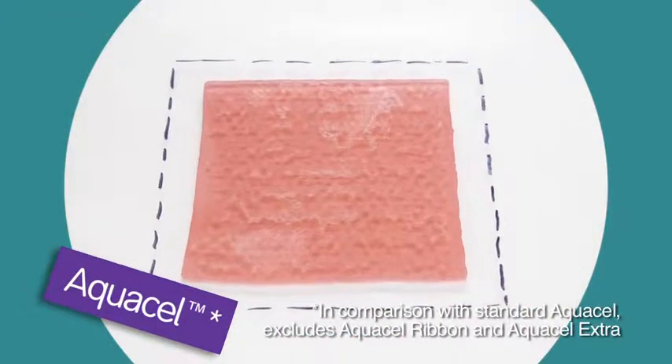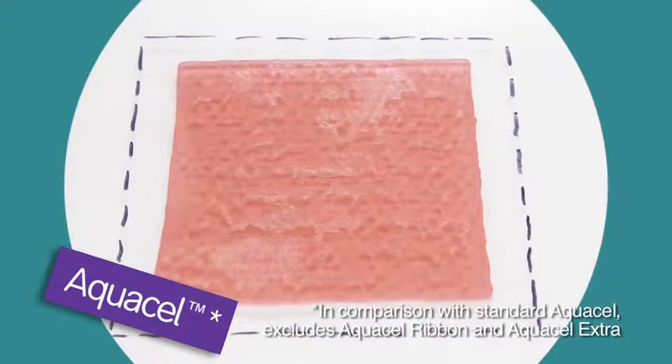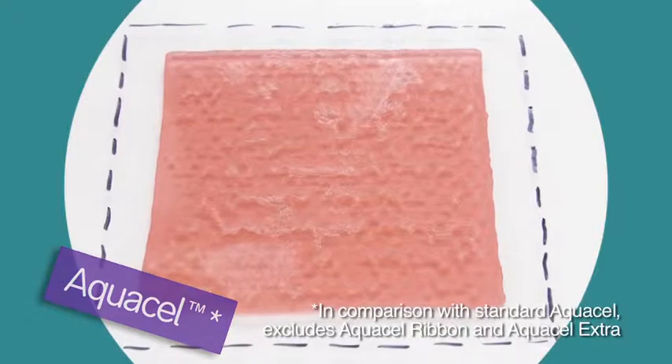And if we compare the gelled Aquacel dressing with the dry measurement we can see markedly more shrinkage than with DuraFibre.